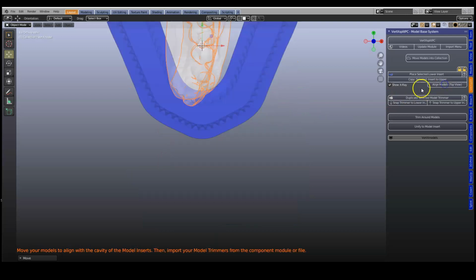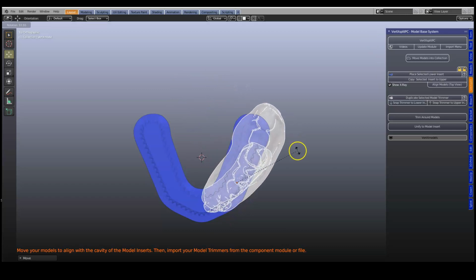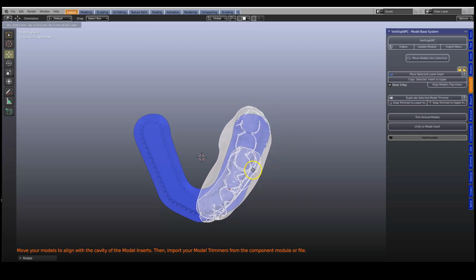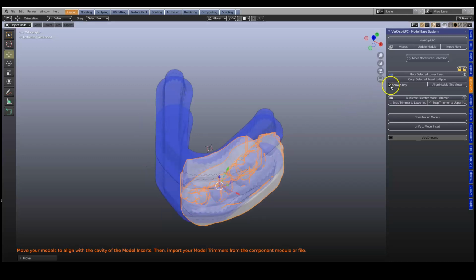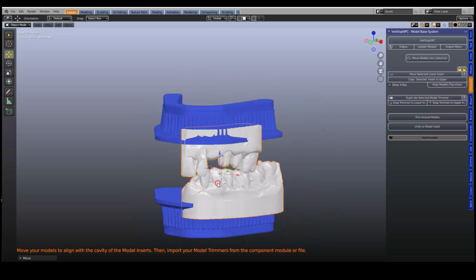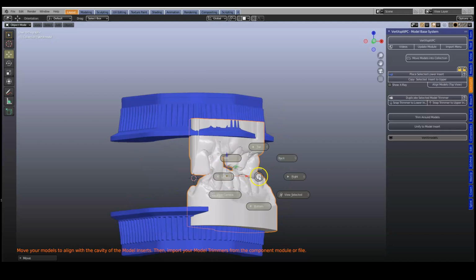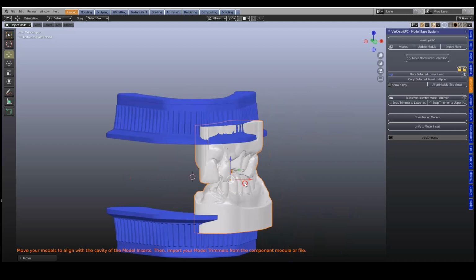Then we're going to align the models. So here we're going to go G, R. Maybe it's because your model was locked, I don't know. G, okay. Let's position these nicely. Let's have a look from the side. Okay. Yep, so we've got a very big model over here. The lower one's very, very big. Okay, so from the front view, we've got that. Okay, so let's leave that.